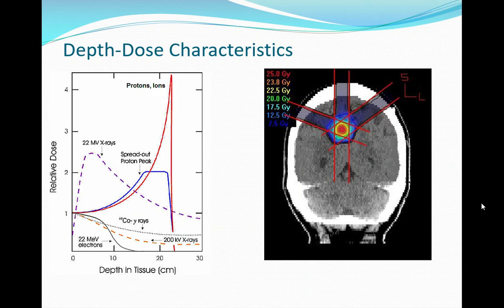Interestingly, when you get up to the megavolts range, or mega electron volts, for these coming in, it's actually different. There's this kind of ramp up from nothing. So this kind of throws some people, because otherwise it looks like an exponential decay, but you expect it to go off like that, right? Well, in truth, it kind of does. It is actually dropping at that. What's happening here is sometimes called the buildup region.